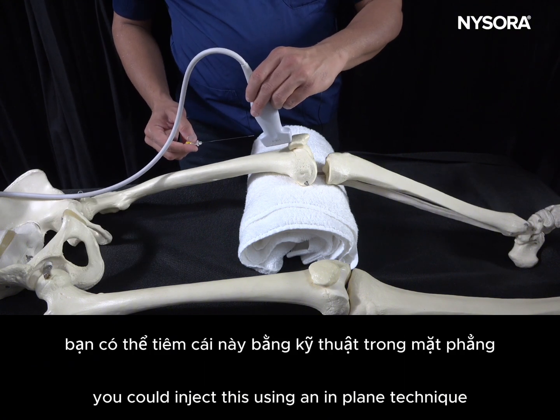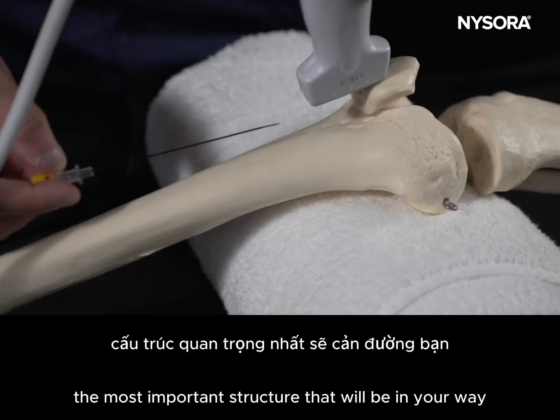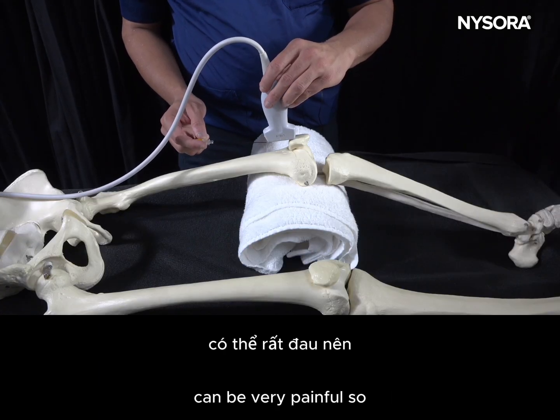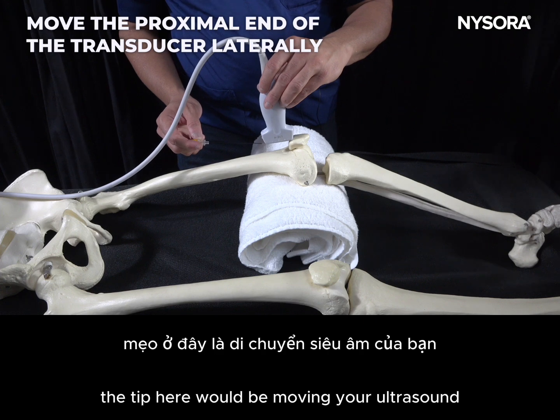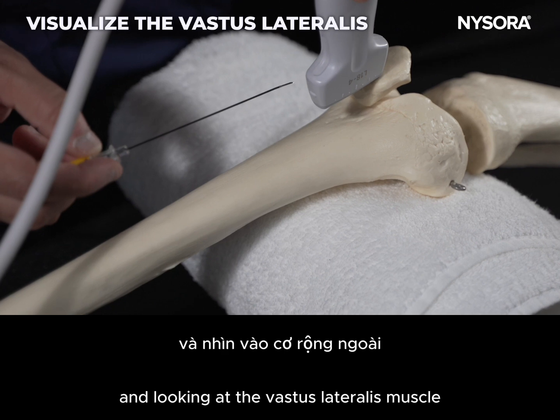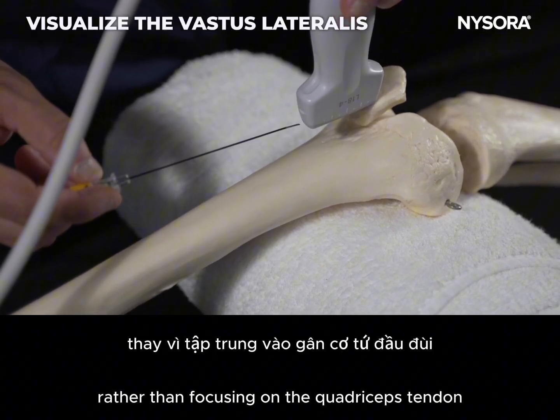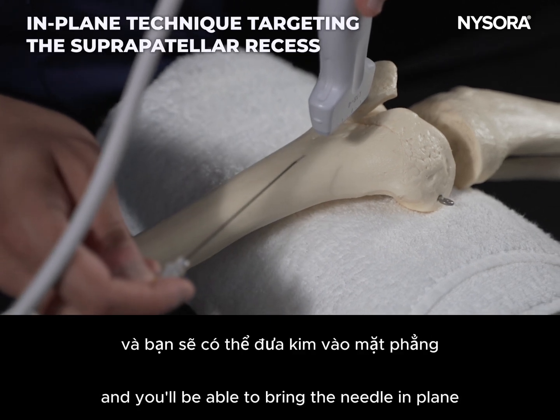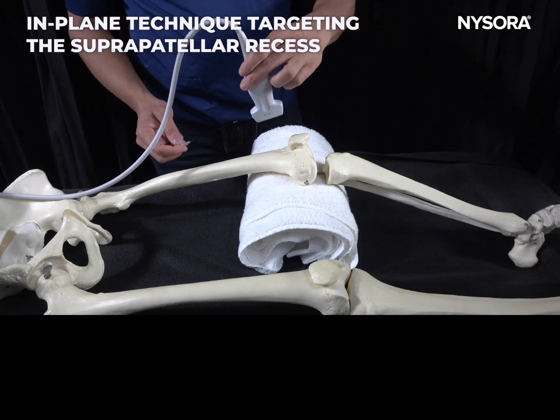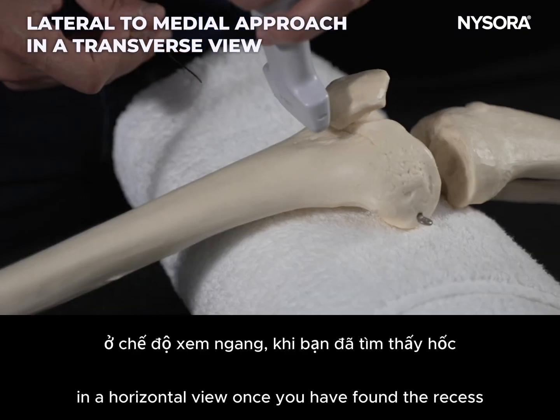You could inject this using an in-plane technique. The most important structure that will be in your way would be the quadriceps tendon, and putting the needle through the quadriceps tendon can be very painful. So the tip here would be moving your ultrasound probe's proximal end slightly laterally and looking at the vastus lateralis muscle rather than focusing on the quadriceps tendon, and you'll be able to bring the needle in plane targeting the suprapatellar recess. Another way to inject the knee joint would be from a lateral to medial approach in a horizontal view.